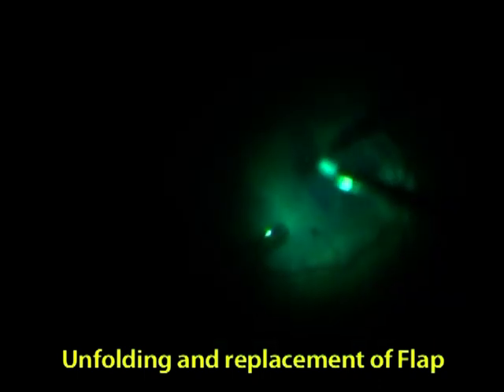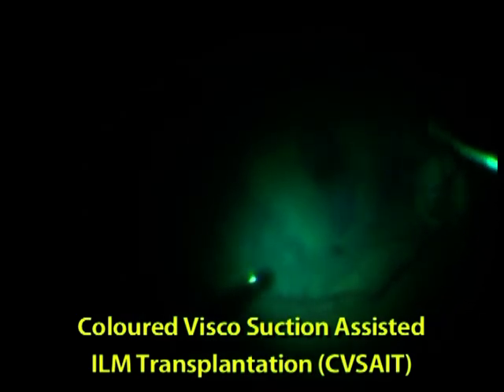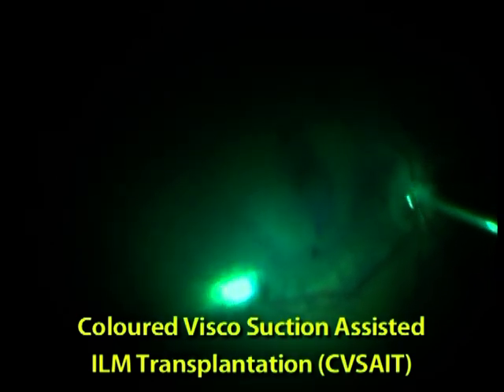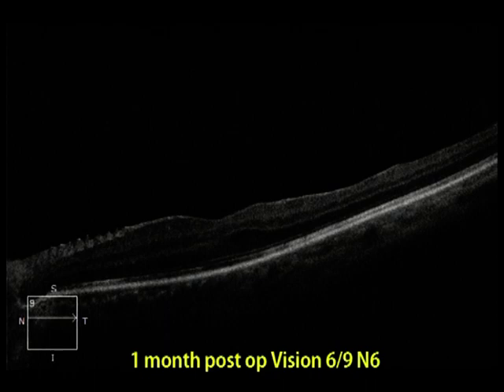So the surgeon unrolled the flap with a silicone tip cannula and perfectly placed it over the hole by active suction of remaining viscoelastic from different directions. The surgeon named it as colored visco suction-assisted ILM transplantation. At the end, air was replaced by SF6. After one month post-op, patient vision was 6/9 and N6.